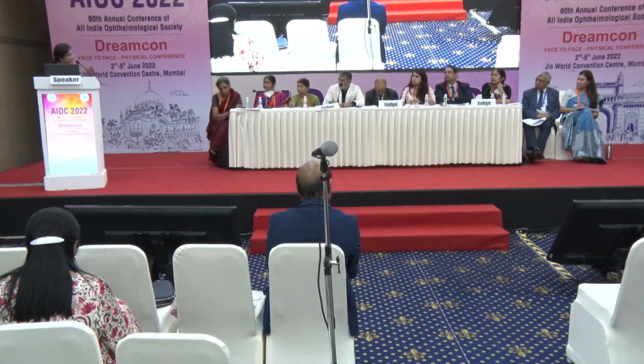But yes, as a screening, we may not be able to pick up the forme fruste where we look for the posterior floats and the pachy. But just to imagine, even if this picks up around 20% of cases which we are not picking and whom we keep doing DALK and PK, it would still be a screening tool. That's the intent behind the study.